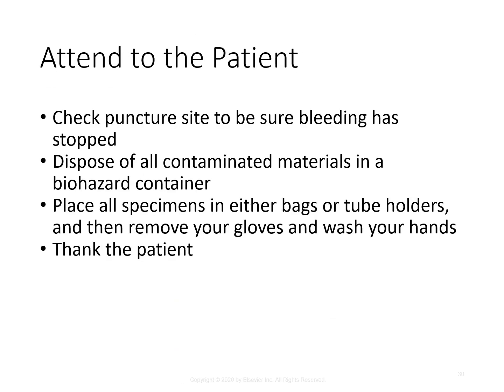Make sure you attend to the patient. Check that puncture site to make sure the bleeding has stopped. Dispose of all contaminated materials in a biohazard container and place all specimens in either bags or tube holders, and then remove your gloves and wash your hands, and make sure you always thank that patient. Nobody's usually super excited to get their blood drawn, so make sure you thank them.